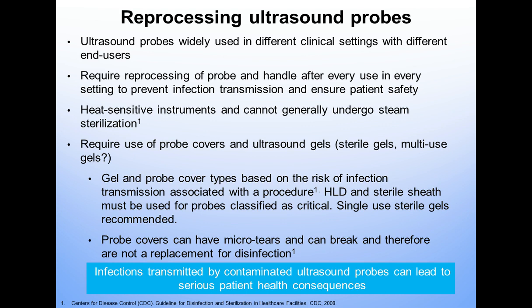There are heat-sensitive instruments, and these cannot undergo steam sterilization. Some equipment now that's being manufactured can undergo low-temperature sterilization. The ultrasound probes can't at this time, but there are transesophageal probes, and the bronchoscopes can go through the low-temperature sterilization. Some of them are also validated for steam.